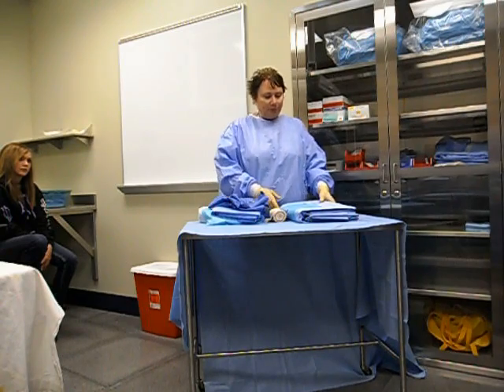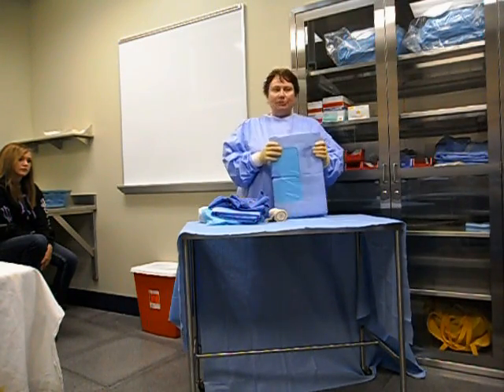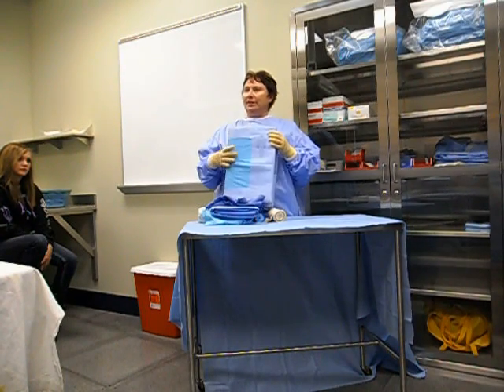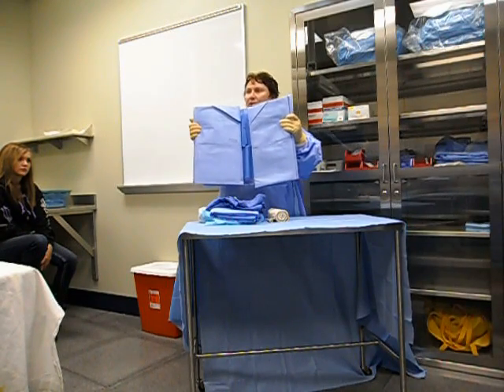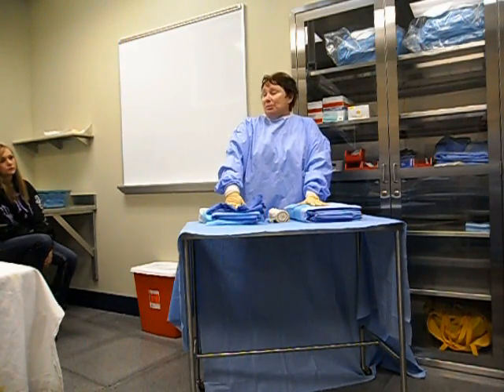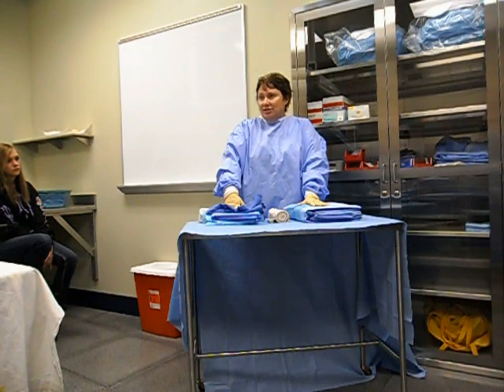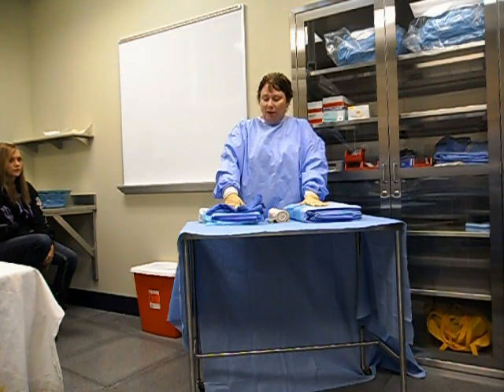And lastly, we're going to use an extremity drape. This extremity drape comes with a picture of a person so you can see the head, arms, and legs. If you open it up, you'll see arrows. To do this draping, it's going to take a couple of sterile people, sometimes even three — your surgeon, your physician assistant, and you, the surg tech. Plus you'll have the RN who prepped the legs.